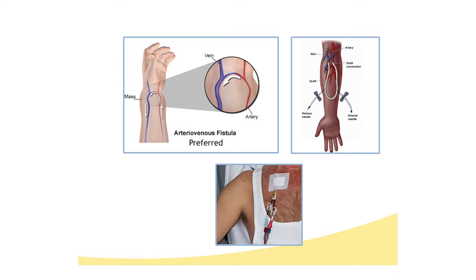That's a standard hemodialysis machine or operation, and you have various forms of access. Now, the national standard and initiative is to have more patients have fistulas. That's why the NKF and other programs are pushing fistula first, because fistulas are a surgical way to turn your vein, here's the vein going to the hand, here's the artery taking blood to the hand, vein going away, it creates a loop in the wrist.